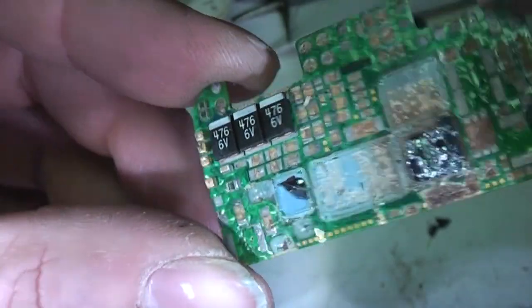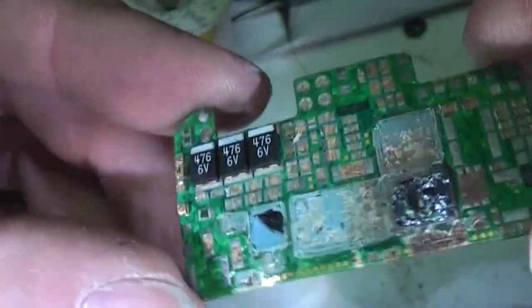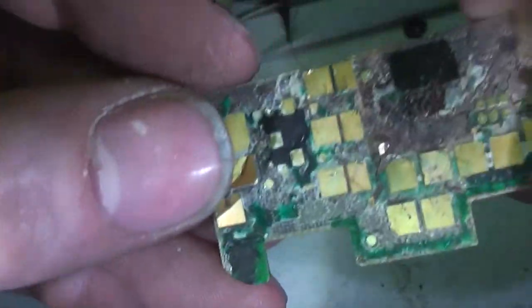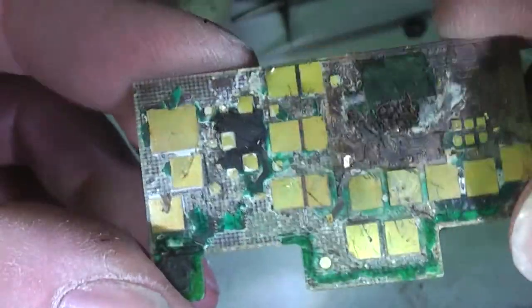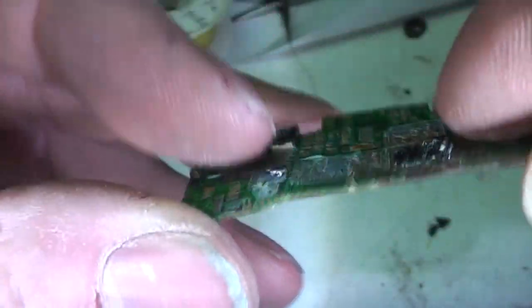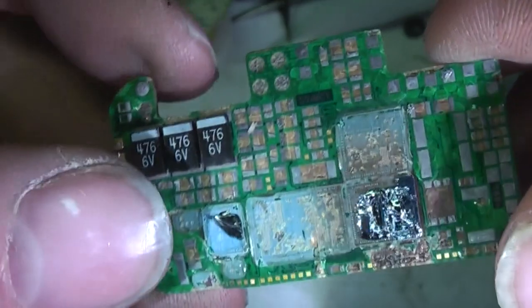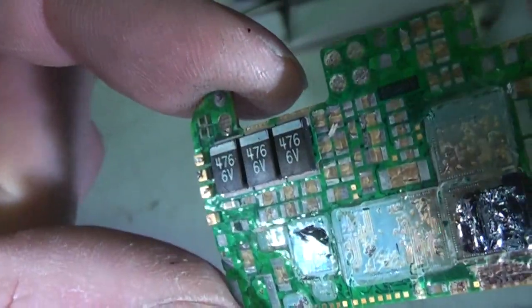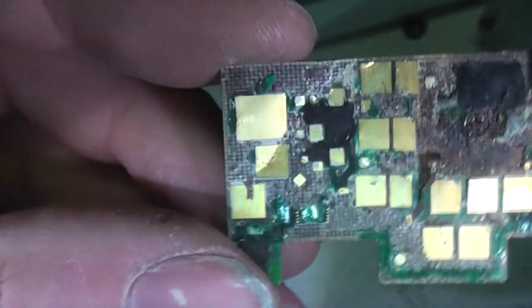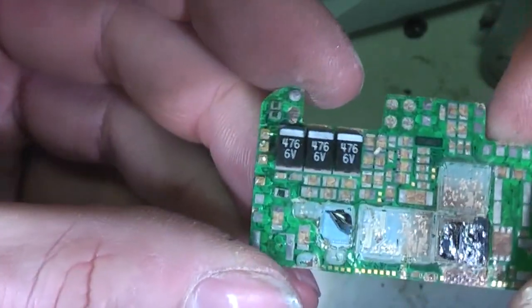You've probably noticed in a lot of standard silicon chip data sheets, a disclaimer saying not guaranteed for life support. So maybe if you're making critical life support equipment like this, your only choice is to make custom chips. But the combination of just the design cost of all this lot, the development cost of the chips and all the approvals costs, the one-off cost of these things must be absolutely astronomical. But very interesting bit of tech, quite different to most other bits of electronics, but obviously this thing is, literally lives depend on it, so it has to be reliable. There's almost certainly a certain amount of redundancy, triplication, self-test, maybe some self-checking type stuff going on here. But very impressive bit of tech.